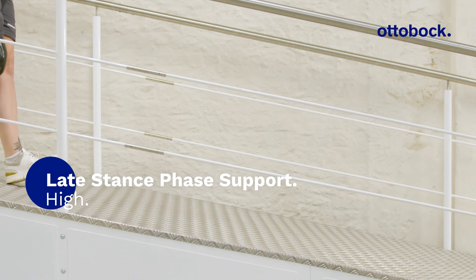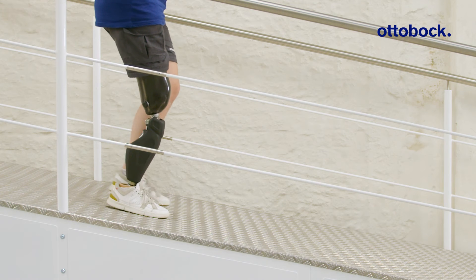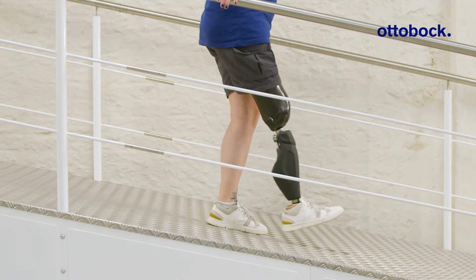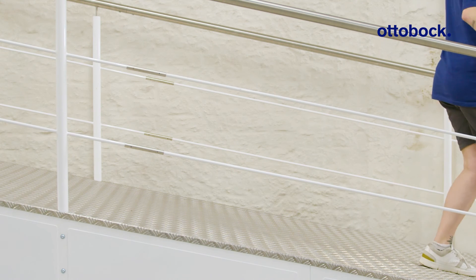A higher support level in the range from five to seven allows more controlled flexion of the knee joint. The flexion resistance increases throughout late stance phase. This reduces the load on the contralateral side at heel strike and facilitates easier foot placement.